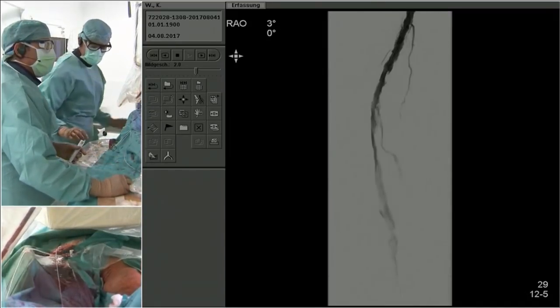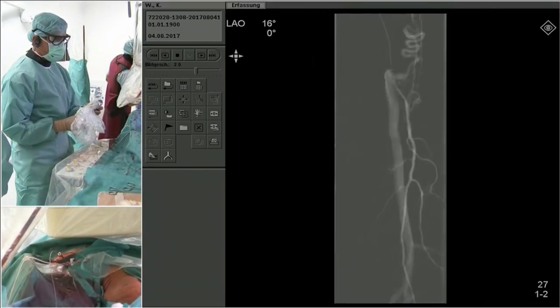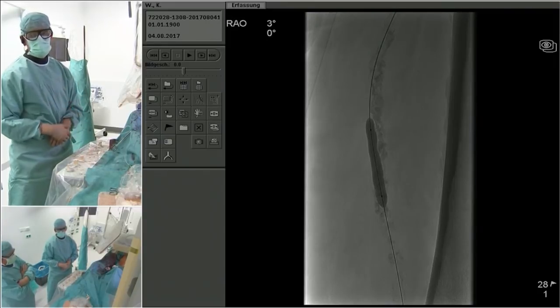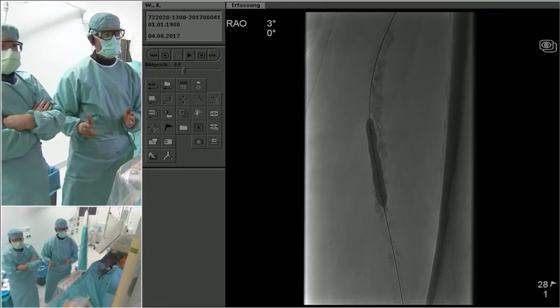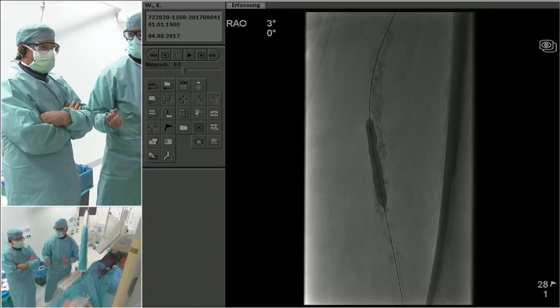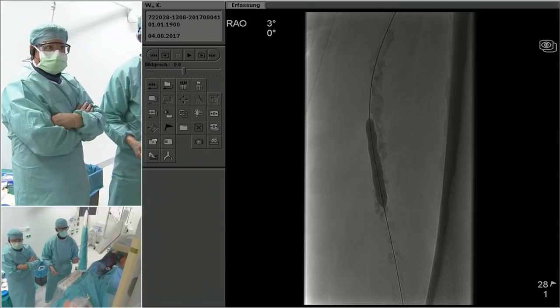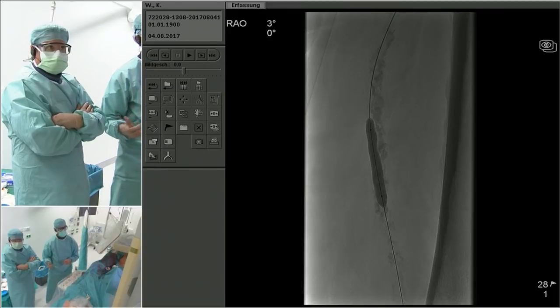The balloon's dilated pretty nicely. Thank you for that. So when it fails... You can see here that this is a 5 by 40 millimeter balloon. This is with 20 atmospheres, and you can see here, if the balloon doesn't open like this, for Supera stent implantation, we all learned that the balloon has to be nicely, fully open, and in extremely calcified lesions, you actually have to also oversize the balloon. So in fact, if I want to take here a 6.5 Supera, I would actually predilate here with a 7 millimeter balloon, or with a 6 millimeter semi-compliant balloon, if I want to implant a 5.5 Supera.